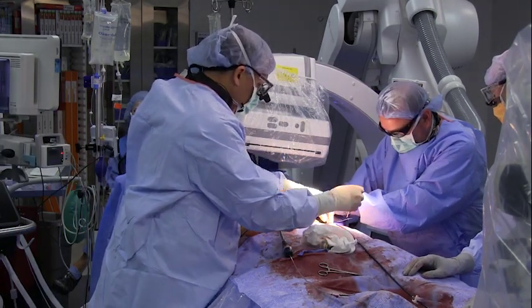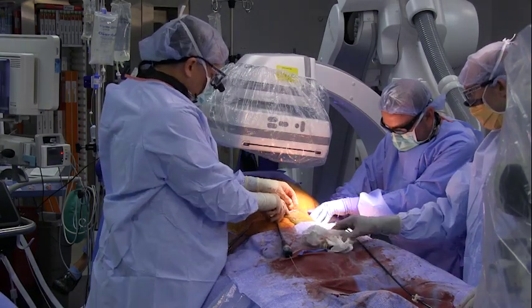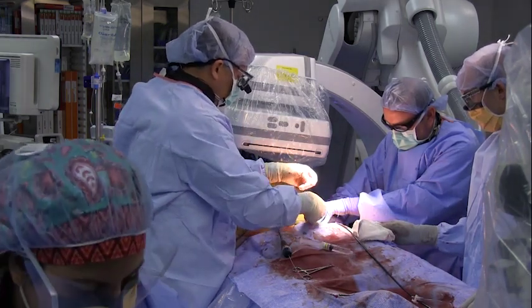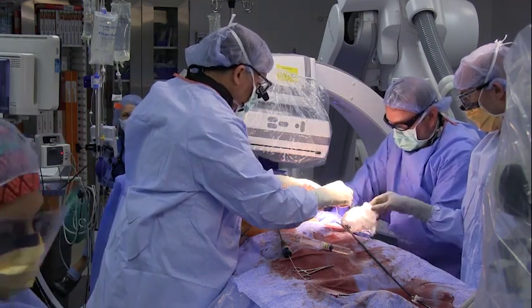If pulsatile bleeding is present, a third ProGlide may be deployed over the existing wire. After achieving hemostasis, remove the wire and apply manual compression. Repeat the same process with the opposite side.